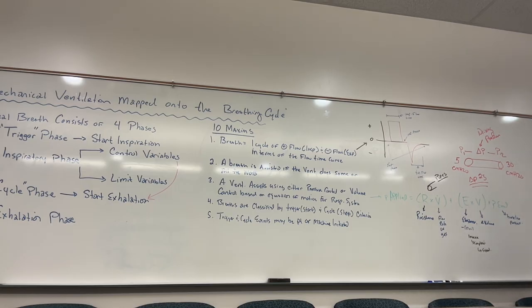And in this case, what direction is the fluid going to flow? Well, if you're talking about mechanical ventilation, you're pushing positive pressure. It's going to drive in this direction, because you're applying this positive pressure here, and it is driving from the higher pressure to the lower pressure, and the fluid will flow like that, all right?